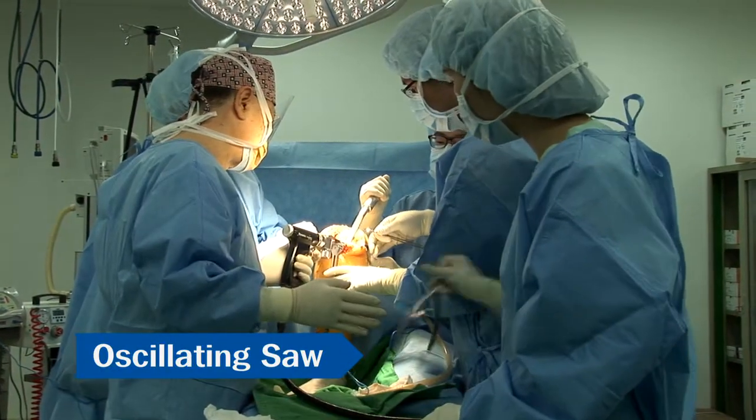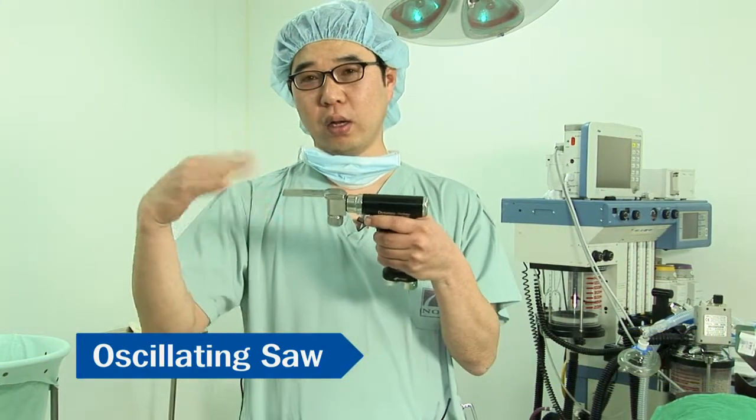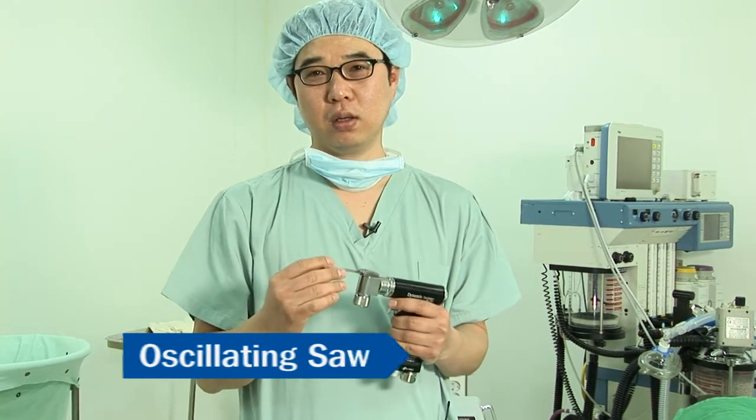Since the blade does not move up and down, there was no vibration during bone cutting. So this saw allows the user to feel plenty of stability when cutting bone.